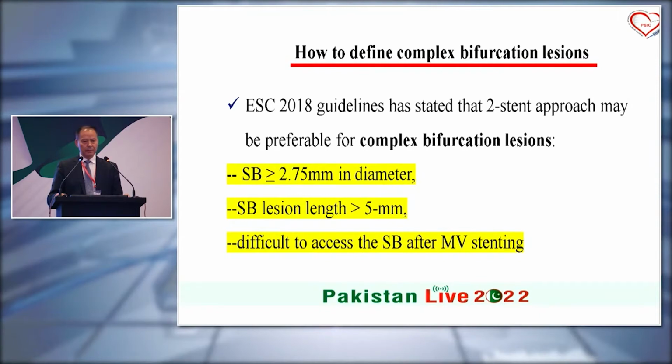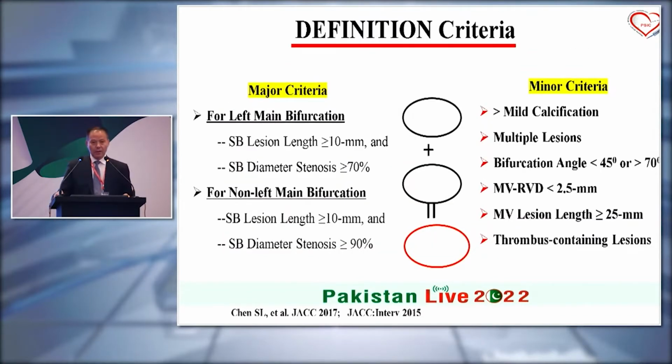So from the beginning of the stenting technique for distal left main lesions, the comparison of upfront two-stent technique with provisional stent technique is a hot topic. It is similar to the negotiation between China and the United States about many, many issues.